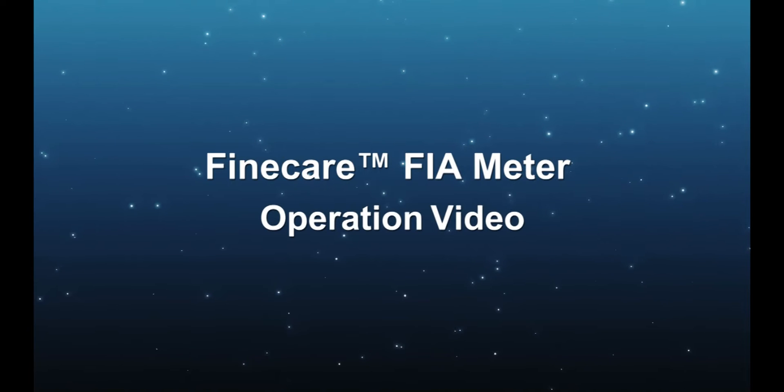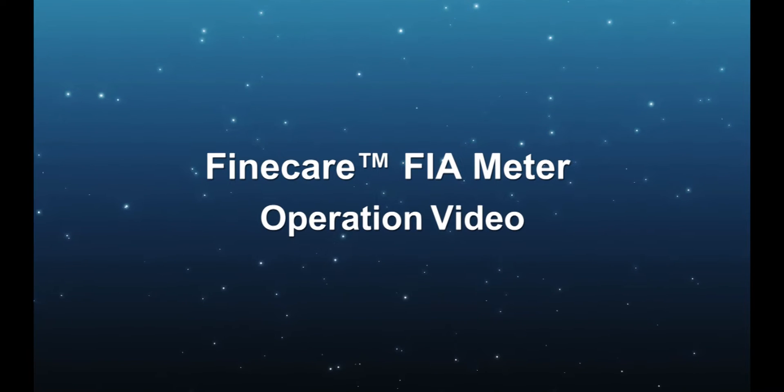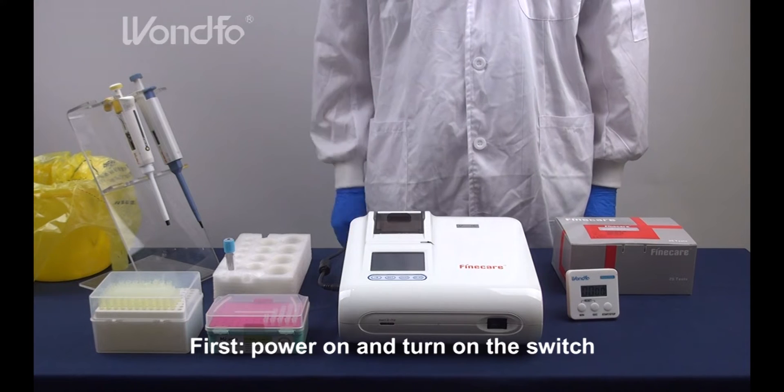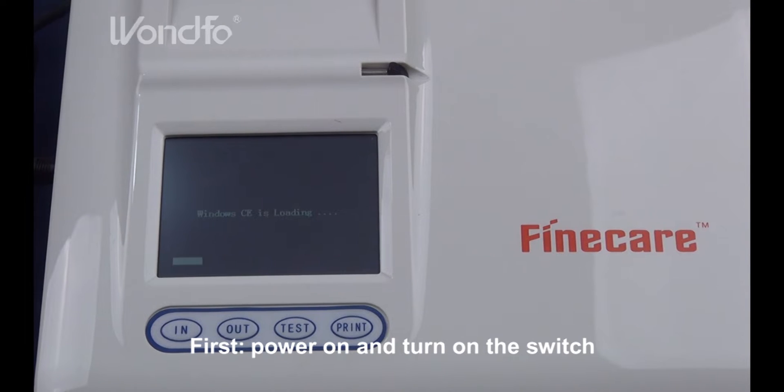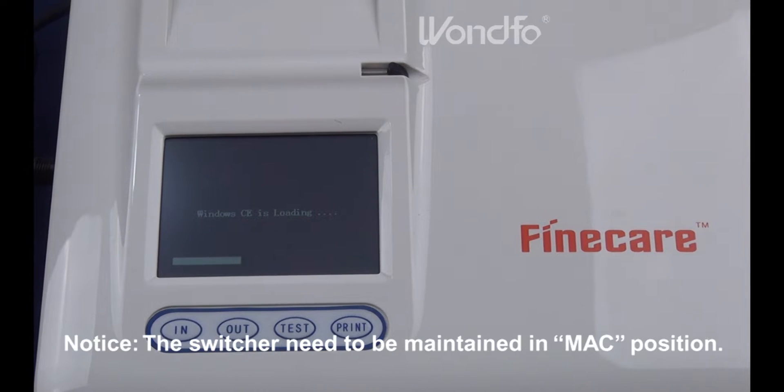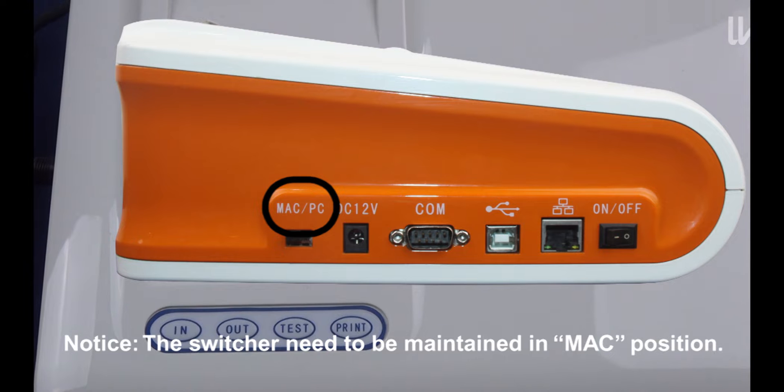Welcome to Wondfo's FineCare FIA meter operation video. First, power on and turn on the switch. Notice, the switcher needs to be maintained in MAC position.